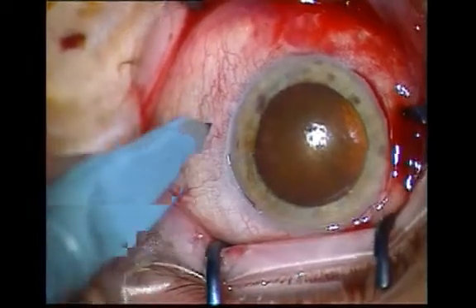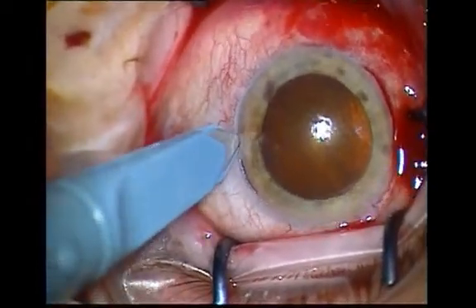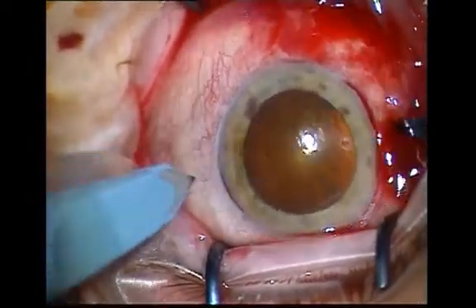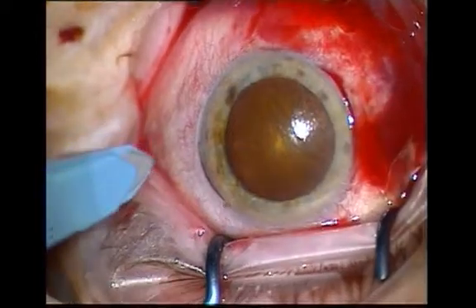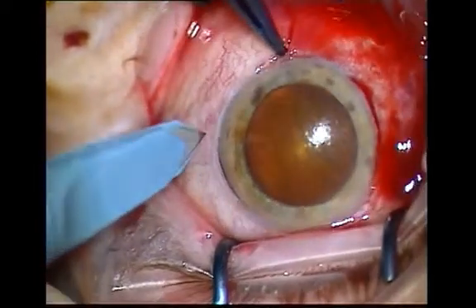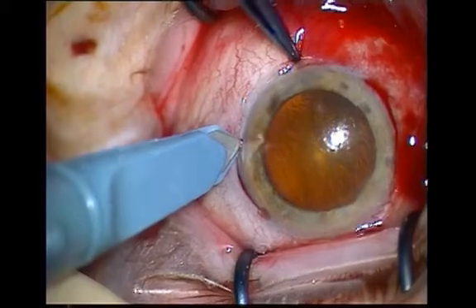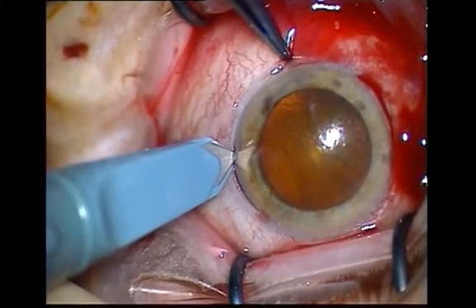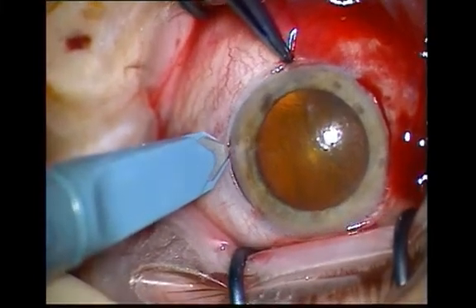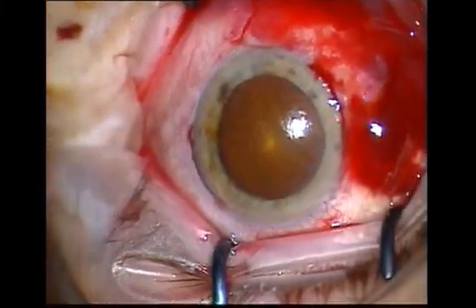Make the incision in one firm movement of arc, while gently rotating the blade in one's fingers, to ensure the cut is regular and creates a smooth arc of the desired length.